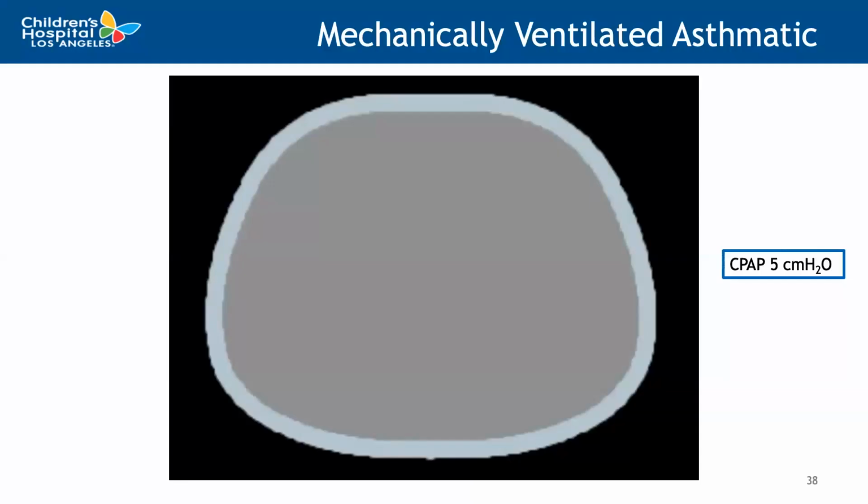So at this time of EIT, the patient was simply on a CPAP trial, and they were unable to pass. So our standard SBT, or spontaneous breathing trial, in our PICU is we put the patient on a CPAP of 5. We usually do this for several hours, and we're monitoring for changes in vital signs as well as work of breathing. And this patient was continuing to fail their SBT for work of breathing.